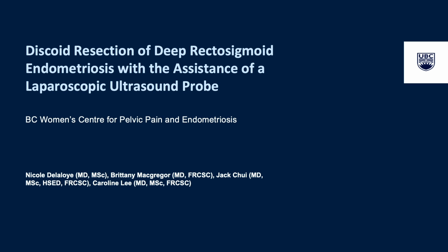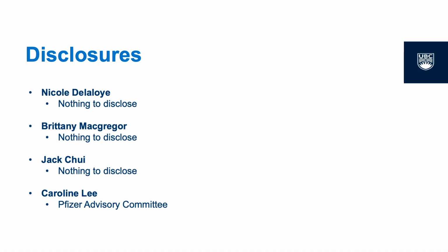Discoid resection of deep rectosigmoid endometriosis with the assistance of a laparoscopic ultrasound probe. The authors have the following disclosures.